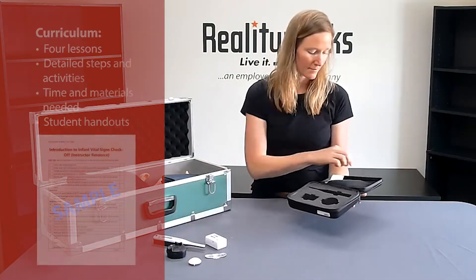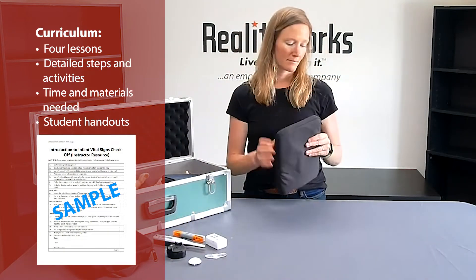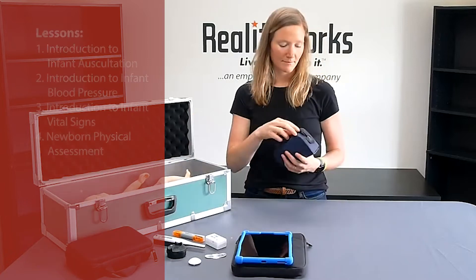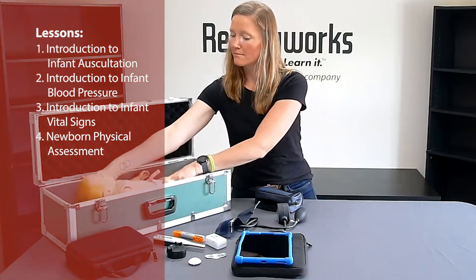The included curriculum includes four lessons. You'll get detailed steps of activities, time and materials needed, plus student handouts. Students will learn about auscultation, blood pressure, vital signs, and physical assessment of infants.